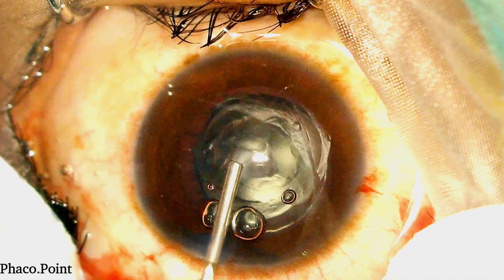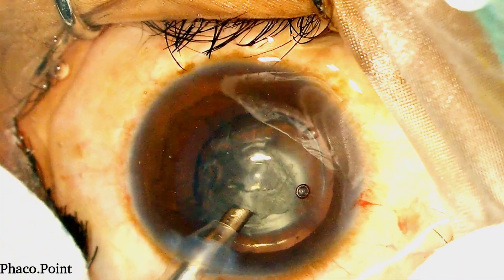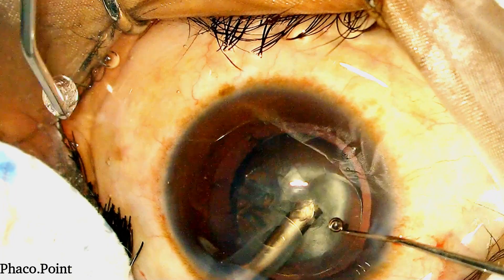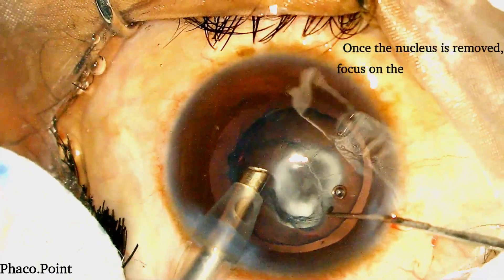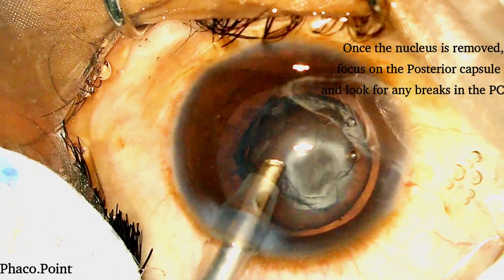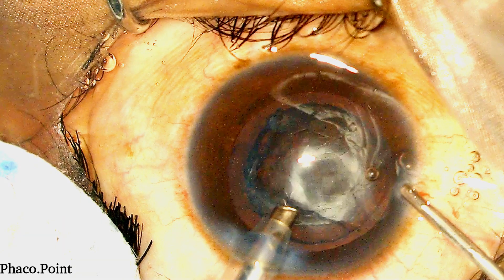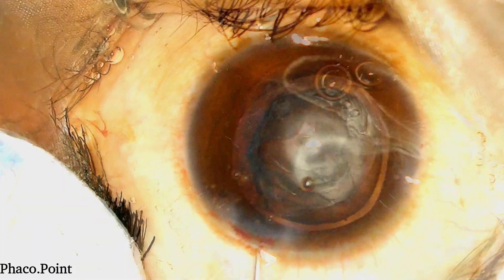We now proceed to nucleus management. As you can see, this is a very soft cataract. With respect to the phaco settings, I'm going to work with a very low power, no more than 20%. When I start to hold on to the endonucleus in aspiration alone, I'm able to elevate and aspirate it. Having completed the endonucleus emulsification, I remove the second instrument and perform a viscofluid exchange. Performing a viscofluid exchange is one of the most important steps during a polar cataract phacoemulsification, because this prevents any shallowing of the anterior chamber when the source of irrigation comes out of the eye. Shallowing of the anterior chamber could get the posterior capsule to rise and could result in a PC rupture.